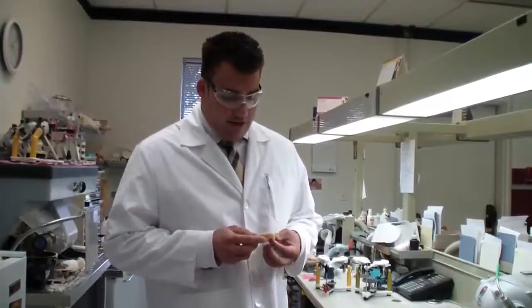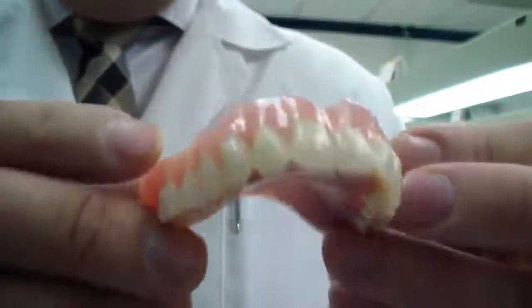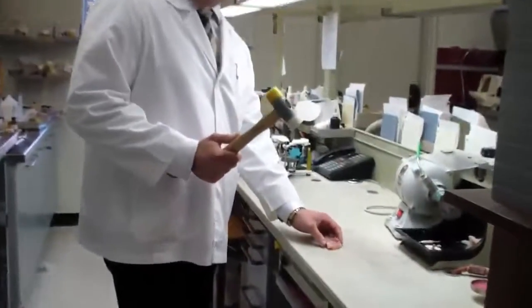Next we're going to do a cast metal reinforced denture. This also has SR IvoCap Precision Injected Acrylic, and just to show you that we're not making this up, there is the cast metal frame. You can see it on this side here a little bit better. So this is not a gimmick — this is real. Let's see how this actually pans out here.